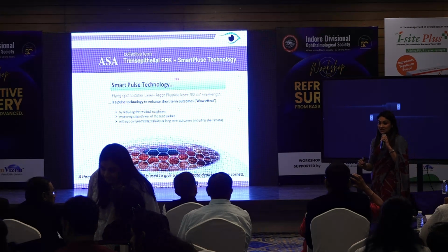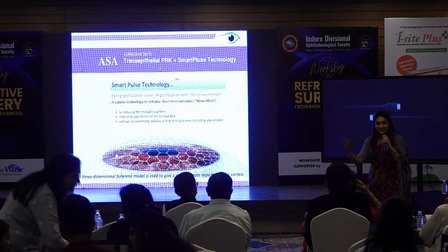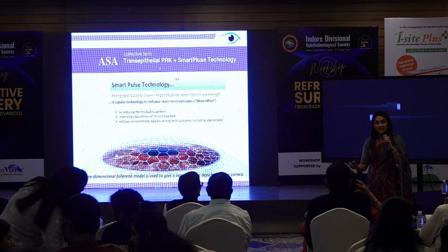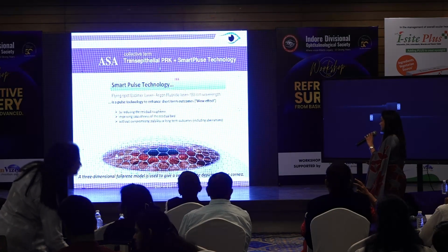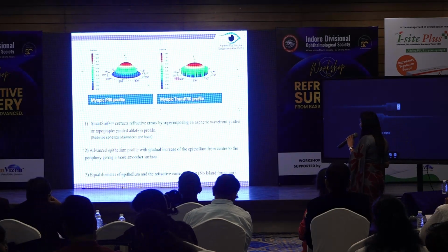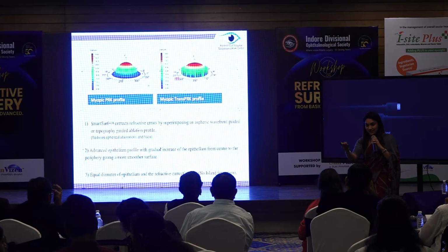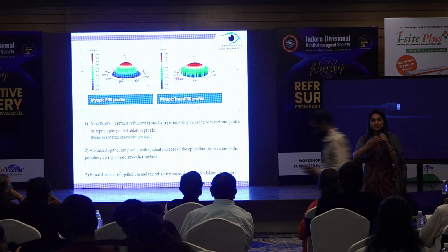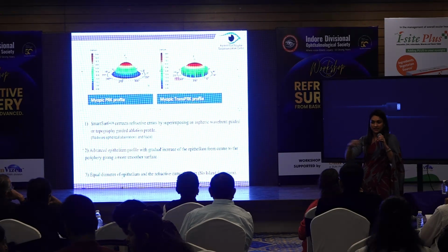When I'm talking about 98%, we have done it in our clinical practice, and we have seen that there's a huge difference between conventional PRK and advanced surface ablation. Advanced surface ablation does not create an island. In conventional PRKs, we would remove an epithelium of around 8 to 8.5 mm and then do a PRK over it.